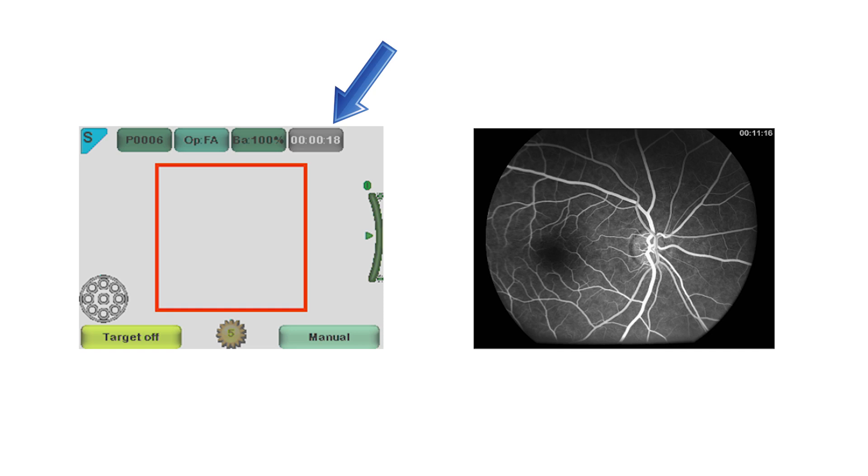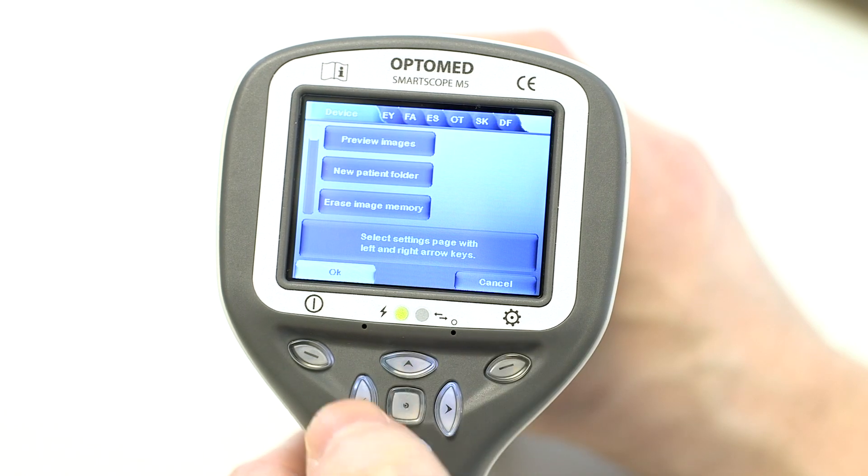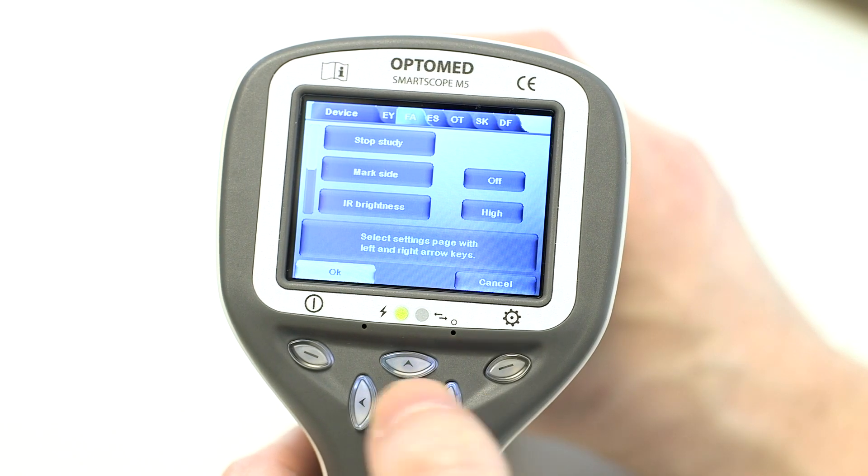The capture time is marked on captured images, and the reader can also see it on the images. To stop the time counter, the user needs to switch to the FA Optics menu and press the stop study button.